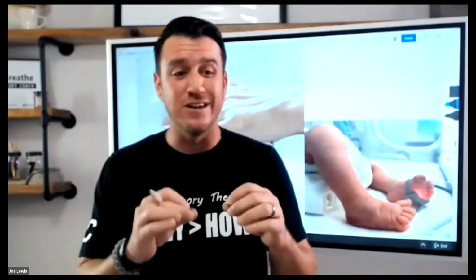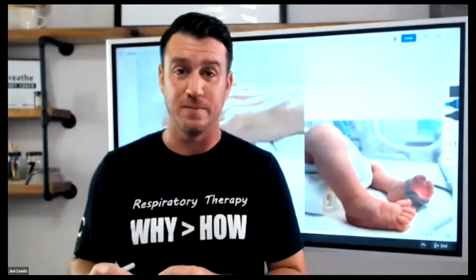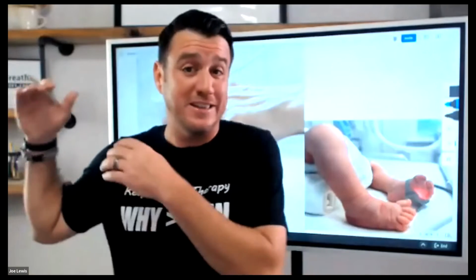So what about targeting that? What about shooting for 55 to 80? What about targeting 88 to 95%? Right? See, my point is that we are utilizing our non-invasive tools to not just prevent dangerous hypoxemic levels, but also diligently wean FiO2s aggressively to prevent hyperoxemia and to prevent these states of hyperoxic acute lung injury.